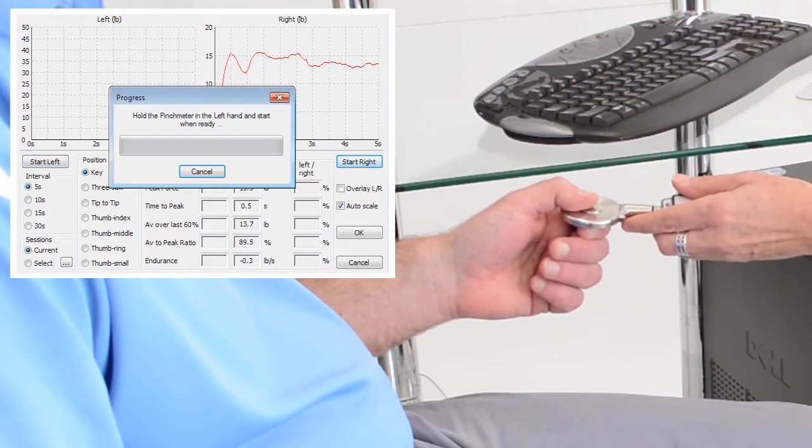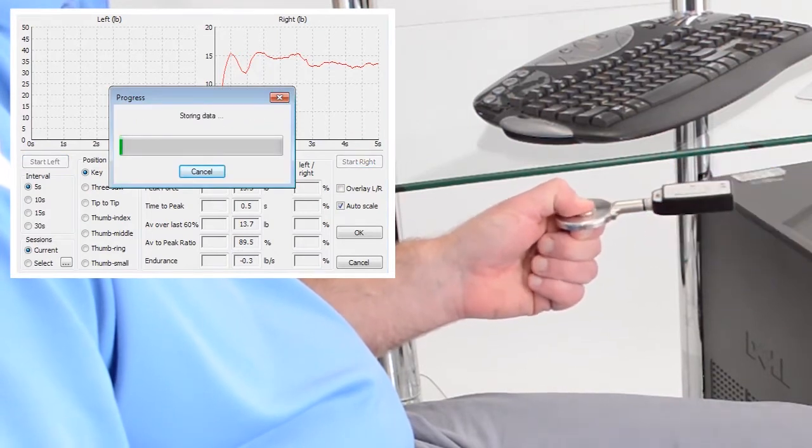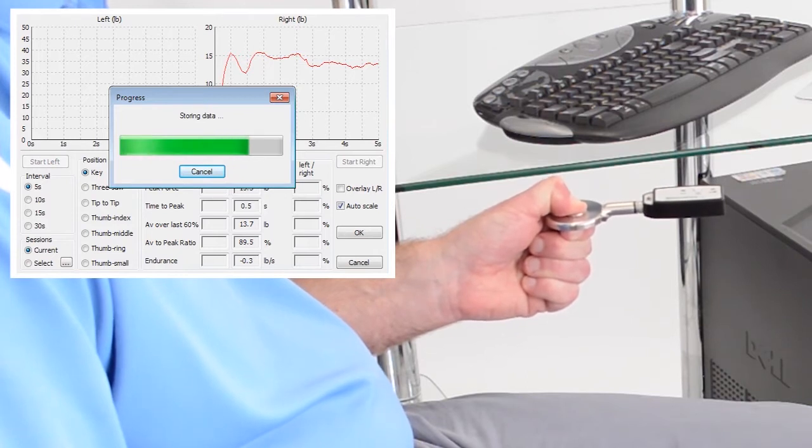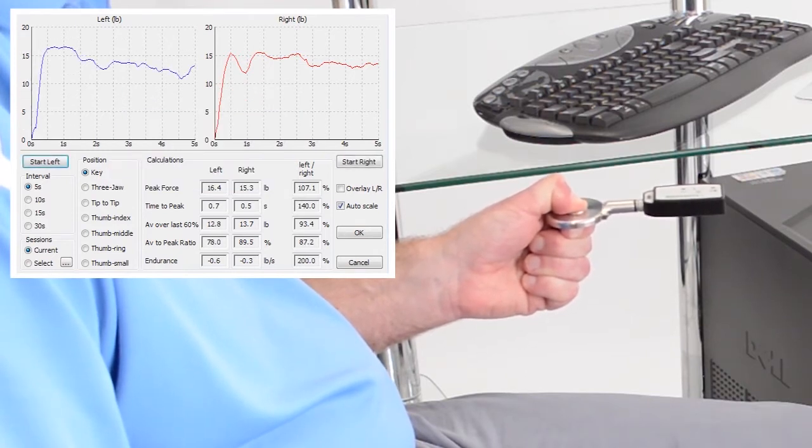As for the dynamometer, so with the pinch meter, e-link software automatically calculates the average coefficient of variation percentage and includes sustained pinch testing.